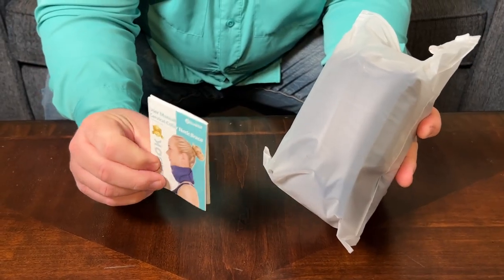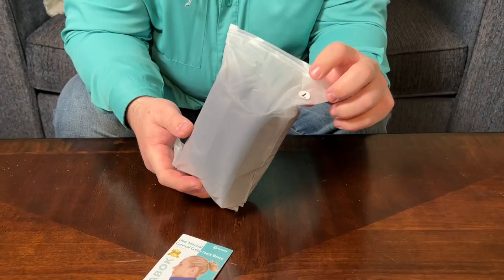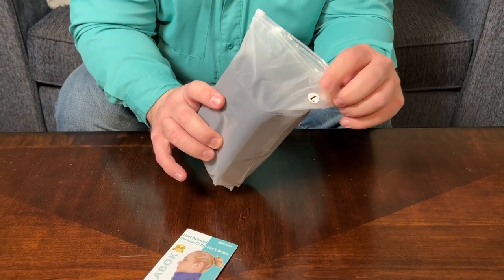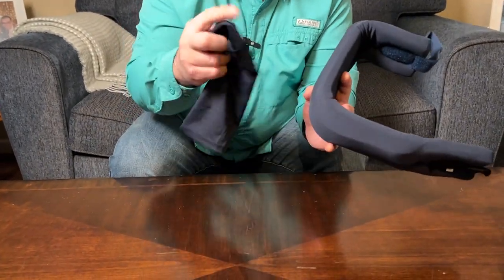Here is the user manual that you get with this neck brace, and it also comes packaged like this. It does have an L on it because I chose the large size, but there are other colors and sizes available. In the bag with the neck collar, you also get this sleeve.